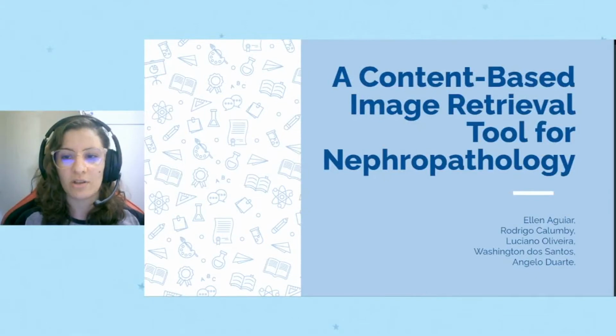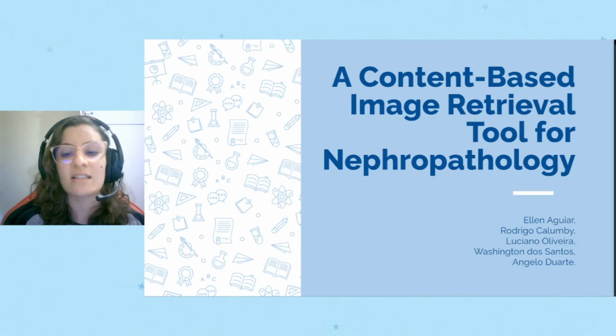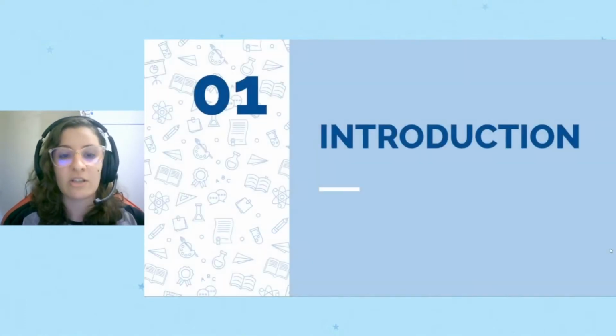In digital pathology, retrieving images from a repository is useful for supporting diagnostic tasks, comparing the progression of a given patient against others, or even creating scientific illustrations. Unfortunately, the typical way a pathologist stores those images makes it difficult to index and search them according to similarity. A possible solution for this problem is using content-based image retrieval systems.